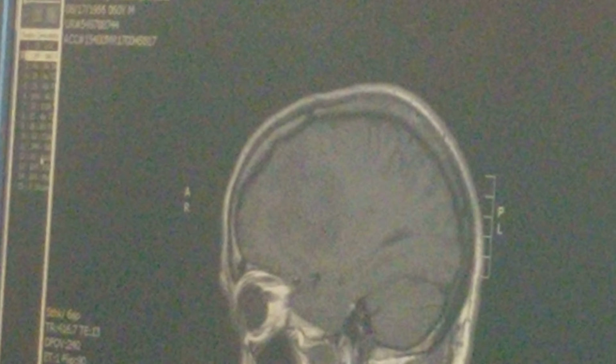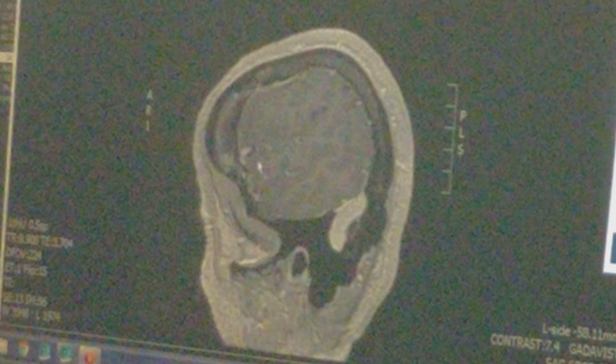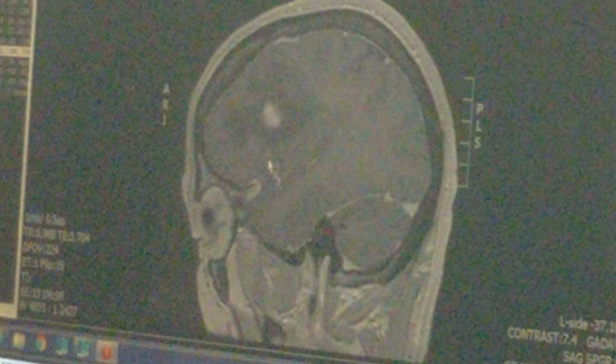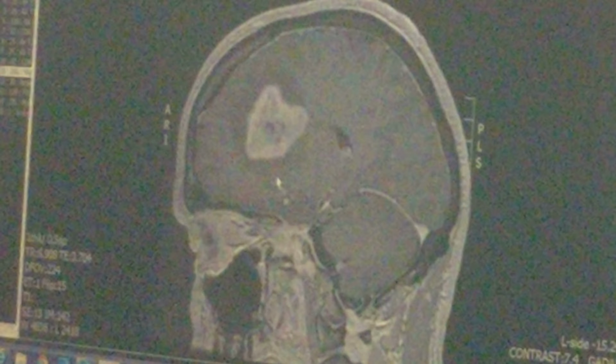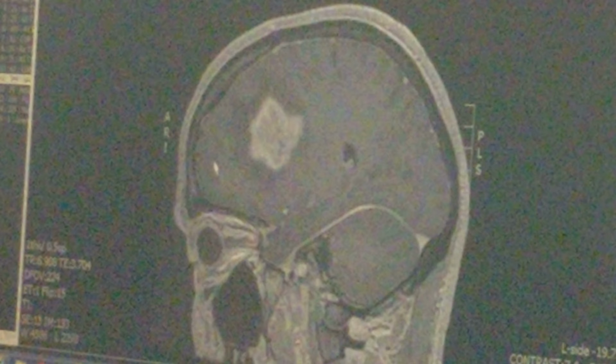This one you're not going to see much. This one you might. So this has got contrast in it, and you'll see that start to form right there. This is a side view? Yes. Sorry, I switched views really quick on you guys without telling you.